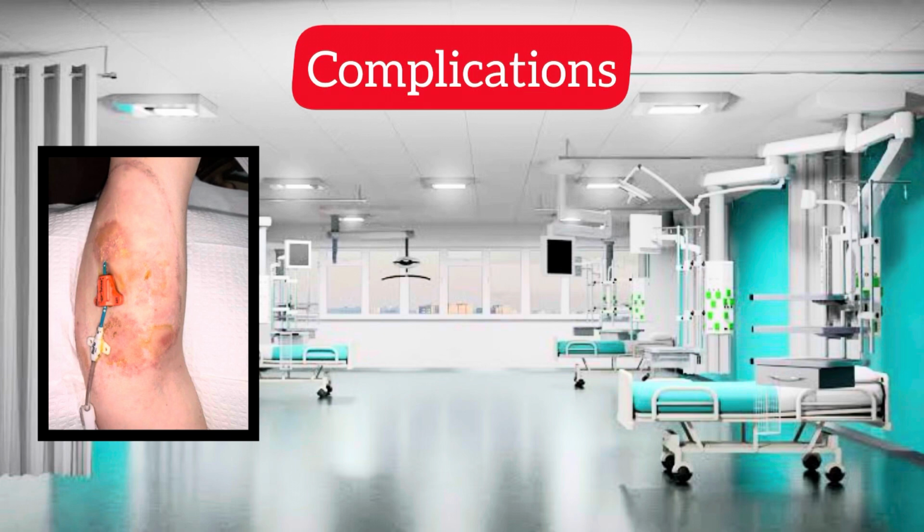Phlebitis or infiltration. Phlebitis and infiltration are complications that occur in 2.2% to 23% of patients with PICCs. It is a result of mechanical damage from the catheter itself or chemical irritation. Phlebitis may occur within the first week after insertion and can be treated using nonsteroidal anti-inflammatory agents or with a warm compress. Removal of the catheter is not necessary if chemical irritation causes it. Diluting medications or administering them at a lower rate can decrease inflammation.